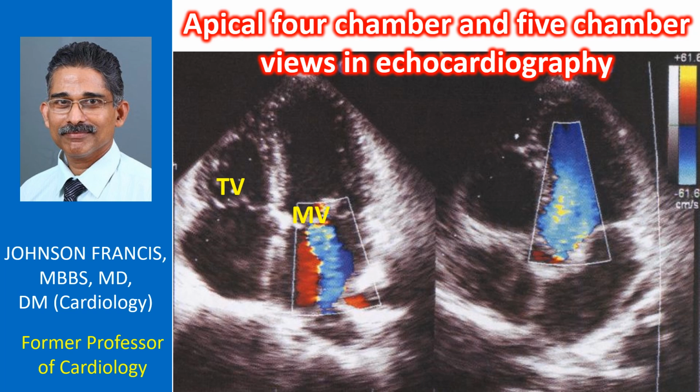The septal tricuspid leaflet will be attached further distally in case of Ebstein's anomaly of the tricuspid valve. The small segment of septal tissue between the attachments of septal tricuspid leaflet and anterior mitral leaflet is known as the atrioventricular septum. Right half of the image shows the apical 5-chamber view.